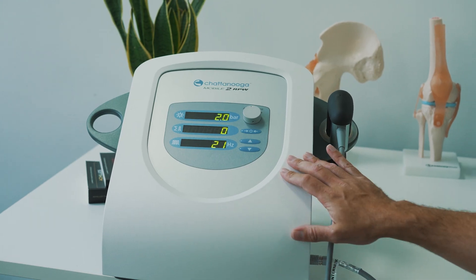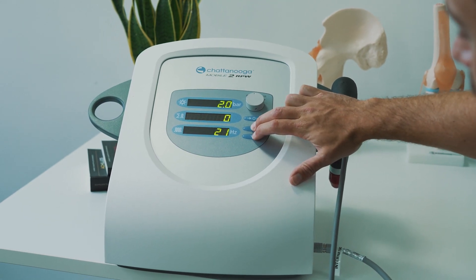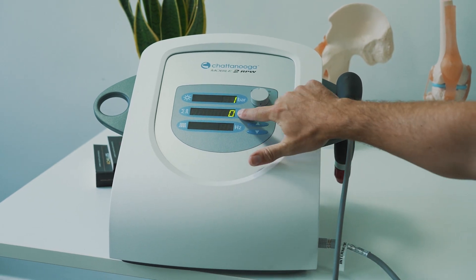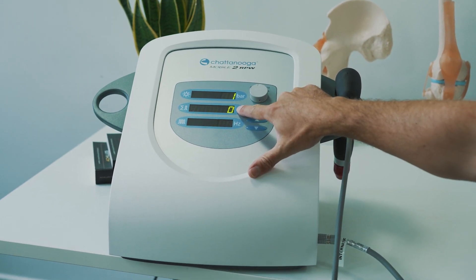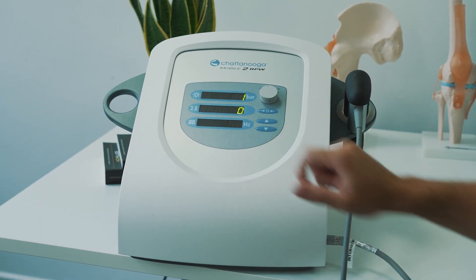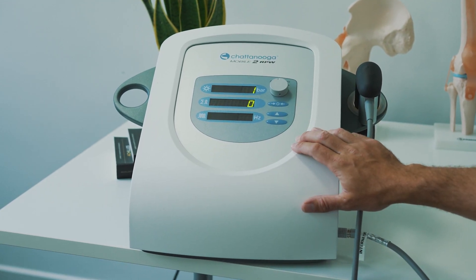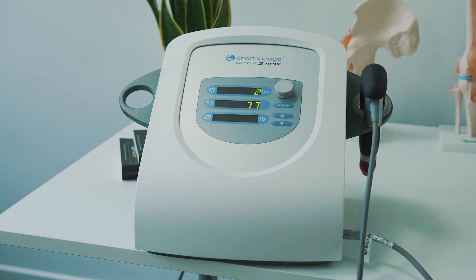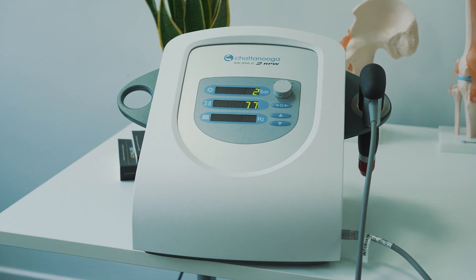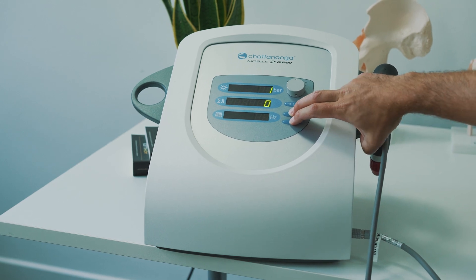To check how many pulses your device has delivered, once it's turned on press and hold the up and down arrows for two seconds — this will bring up a separate menu. The number shown times by a thousand is the number of pulses you've delivered. When this reaches 1 million, you're ready to complete the revision of your handpiece. The second menu shows you the number of pulses completed on the handpiece during its lifetime. To return to the normal menu, press and hold the up and down keys.